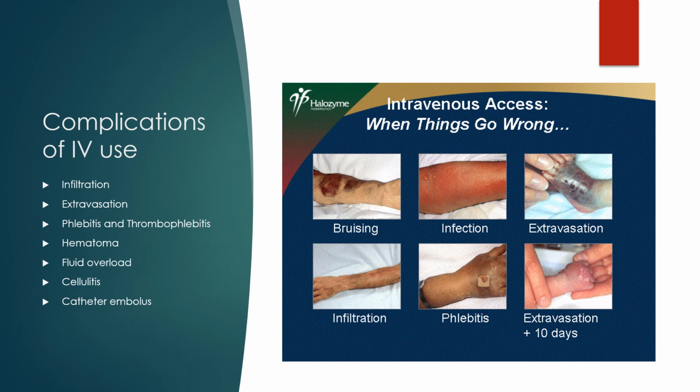First of all, we can't use that IV. You've blown it, so you can't use it. You've got to take it out, put another one in, either proximally or higher above the area or in a different extremity, and then just protect that arm. You can use a cool compress if the patient's complaining of any discomfort.